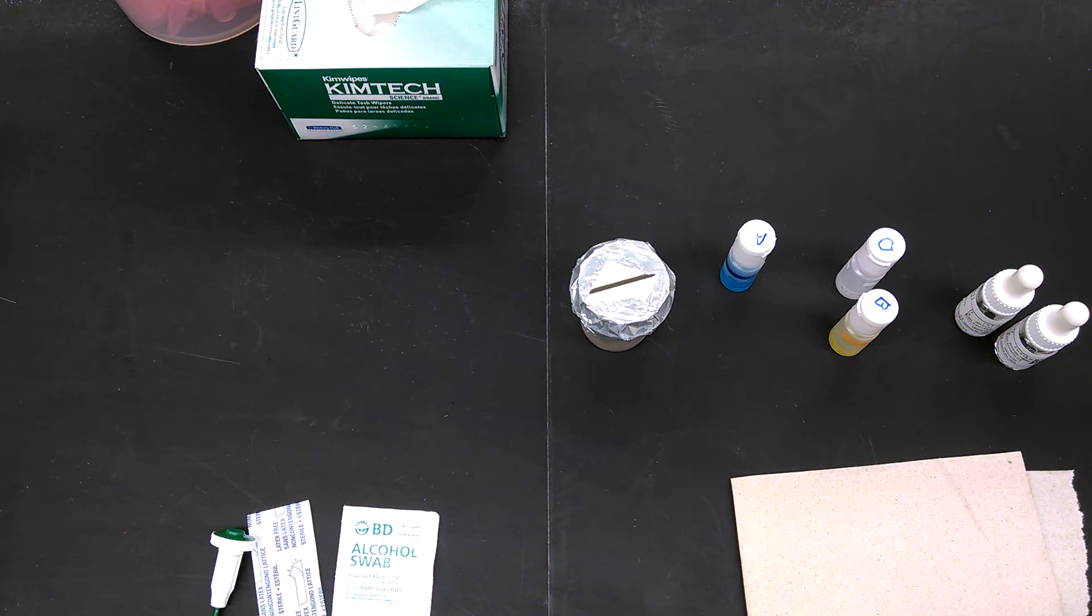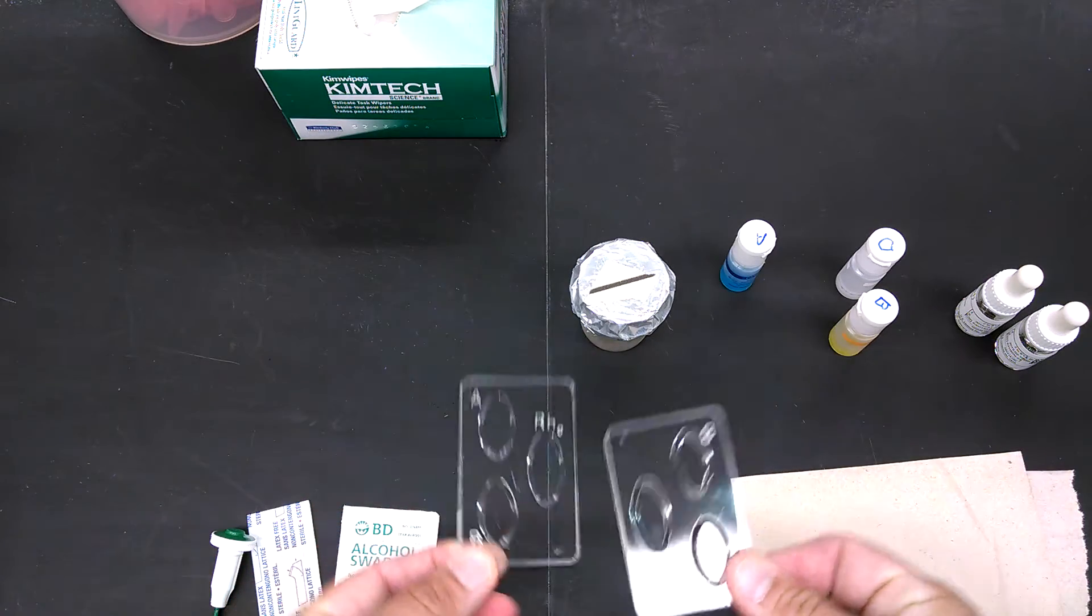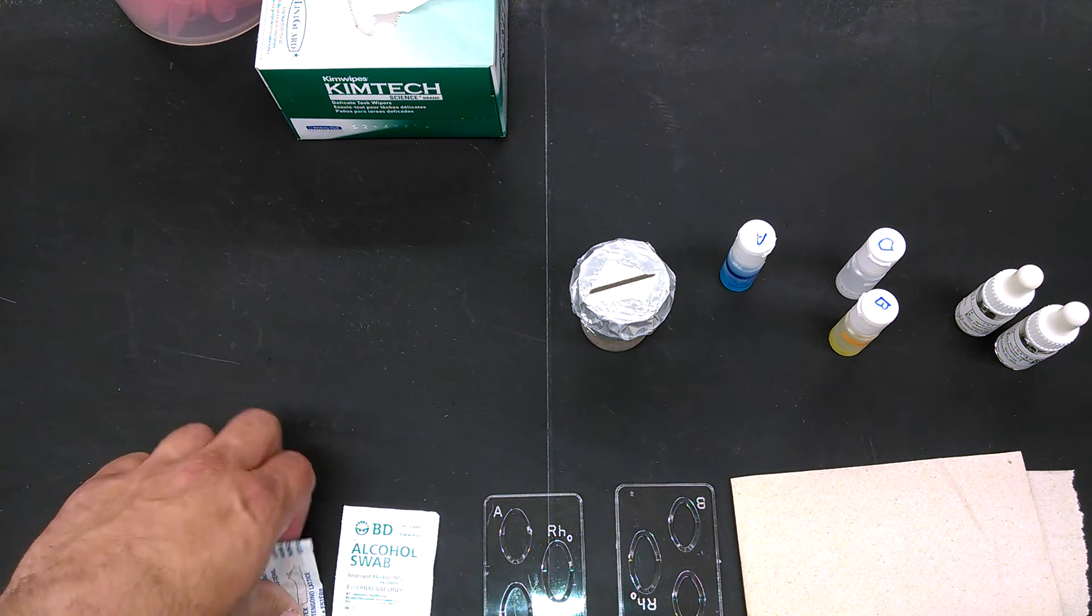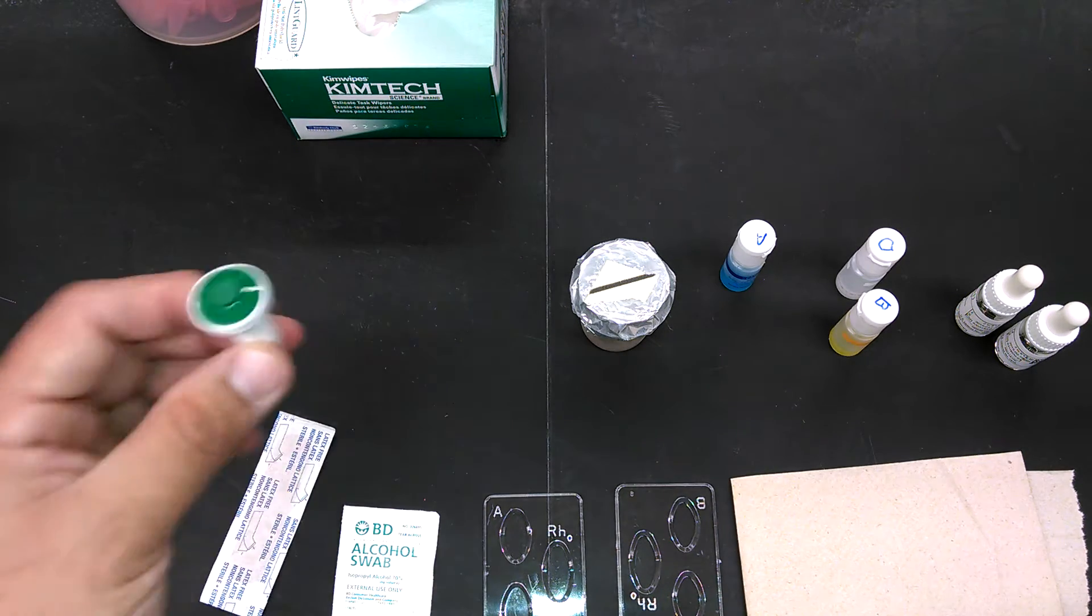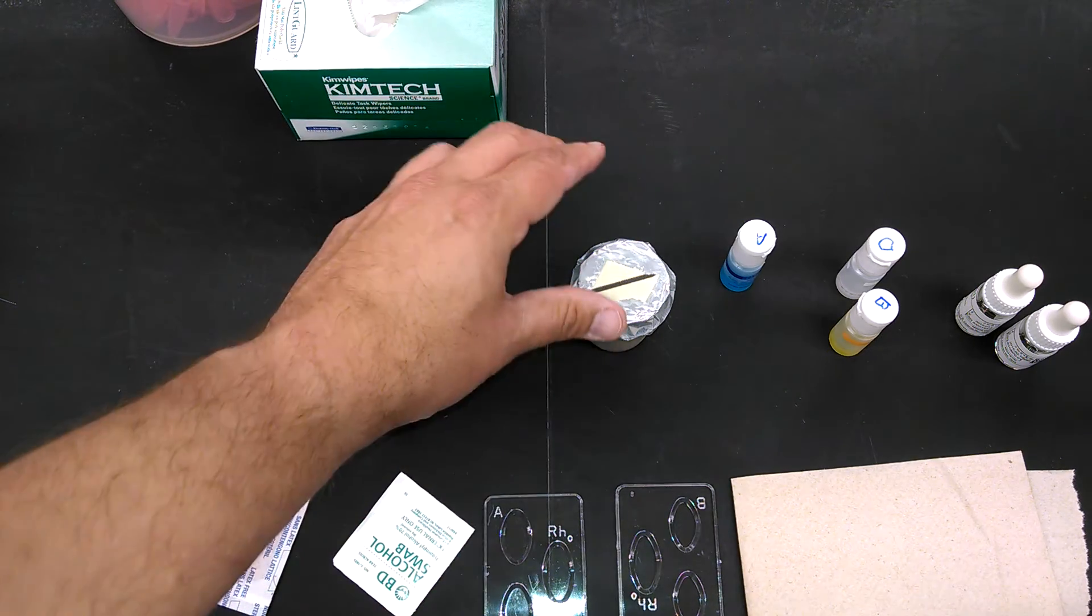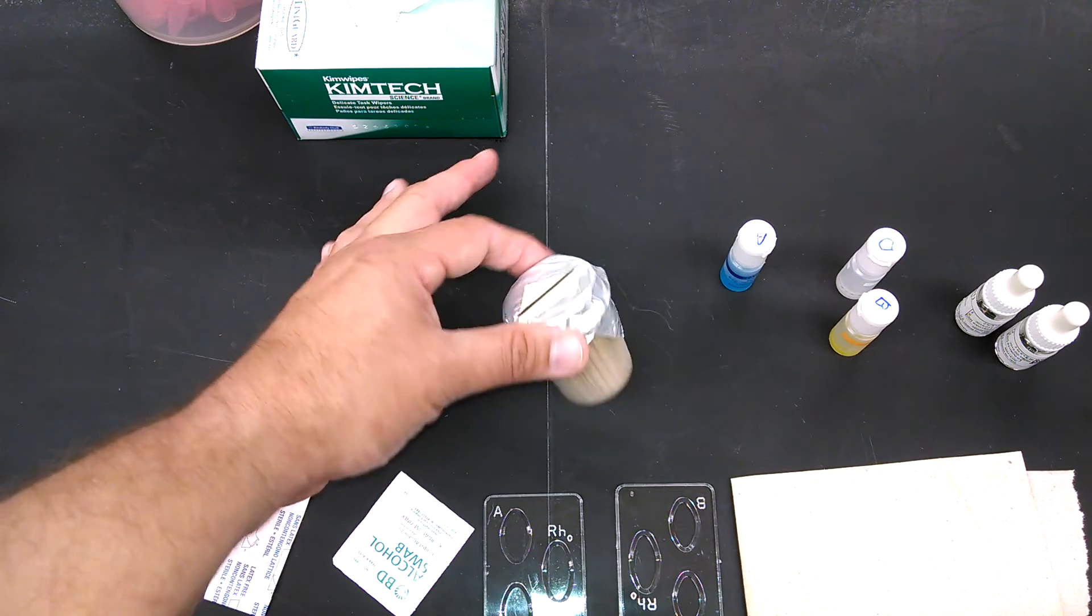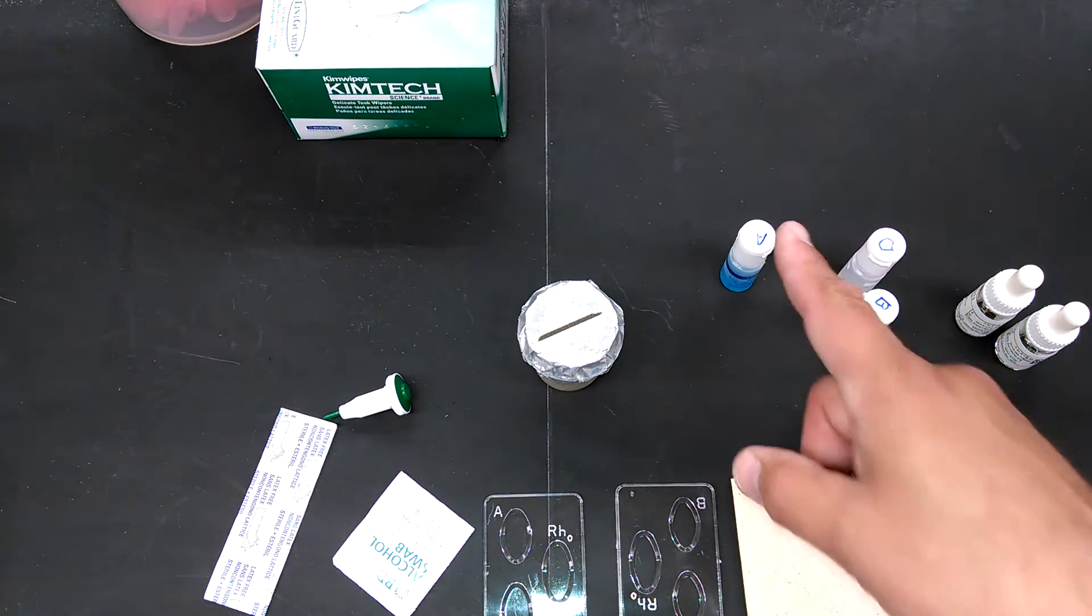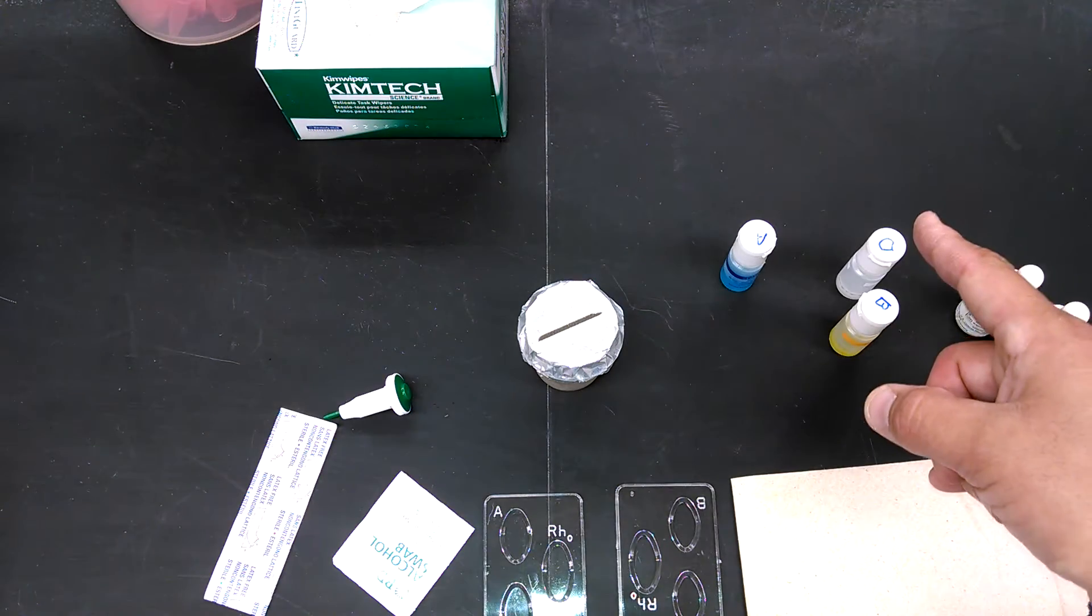You will need two slides, a band-aid, a lancet, an alcohol swab, some toothpicks, and you'll need access to the antibodies A, B, and D.